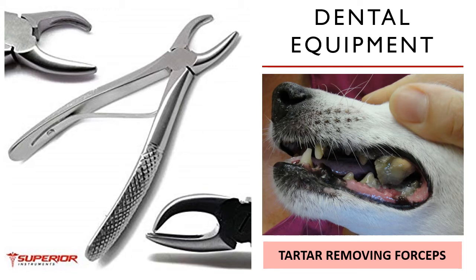Calculi depositions as big as shown in this picture are recommended to be removed by the tartar removing forceps because your scalers just cannot do the trick. If you force to use your ultrasonic scalers on this tooth, your scaler would go blunt, the tip would easily be worn out, and you'll just be damaging your machine when a simple forceps can do the trick.